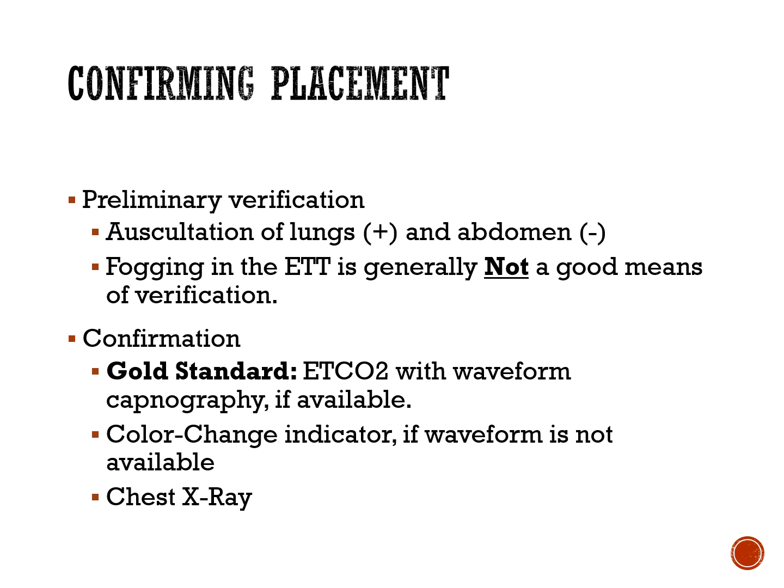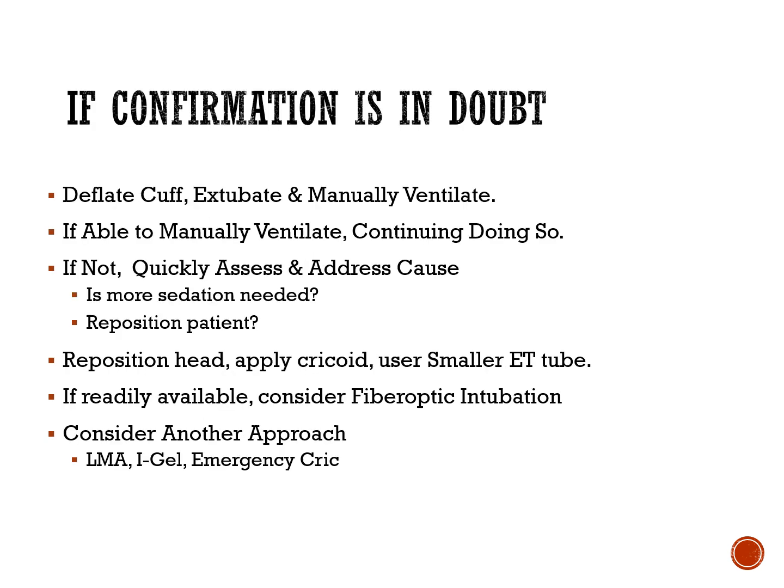So if you had a visual, you have positive end tidal, but the saturation continues to drop modestly, briefly, I wouldn't use that as a sole reason to deflate, extubate, etc. I would just hold off and monitor the patient very carefully. If it continues to drop, then I would say that you should deflate, take the tube out, and start ventilating and oxygenating the patient quickly. If confirmation is in serious doubt, I just gave you the example where it's in that gray area, not really sure. But if it's really in serious doubt, okay, deflate the cuff, extubate, and manually ventilate and oxygenate the patient.